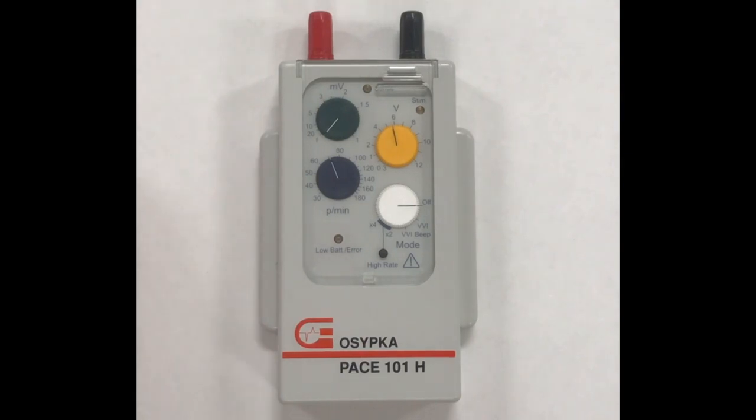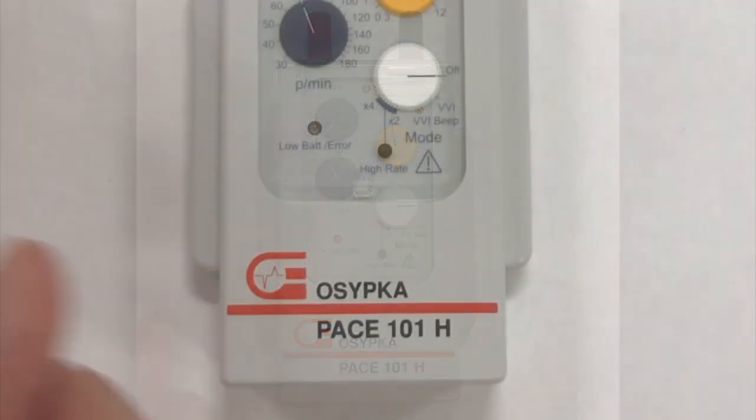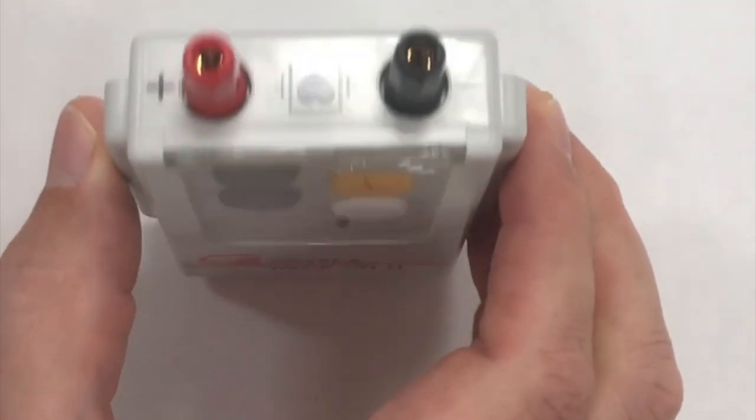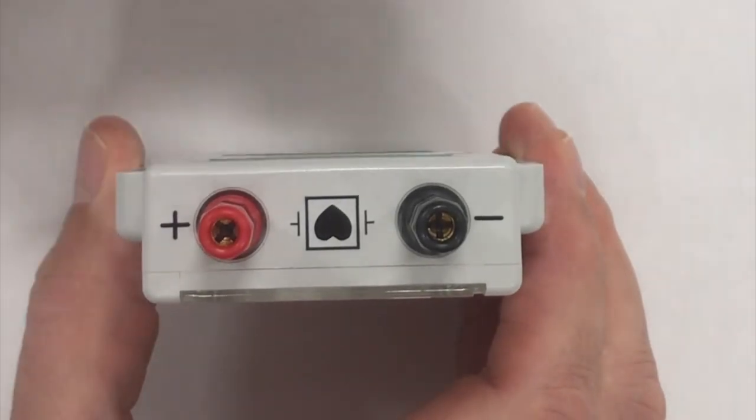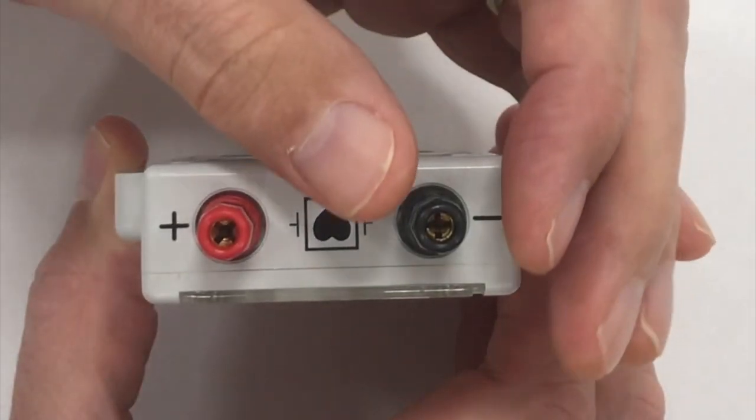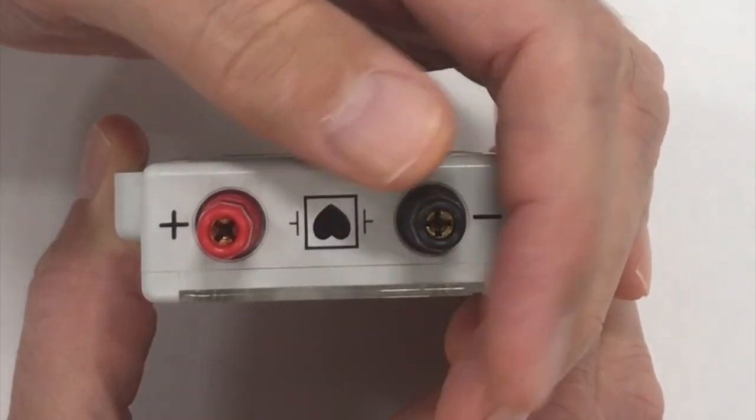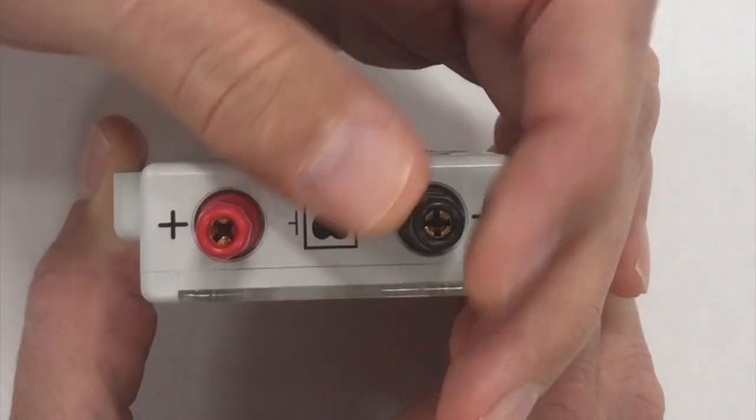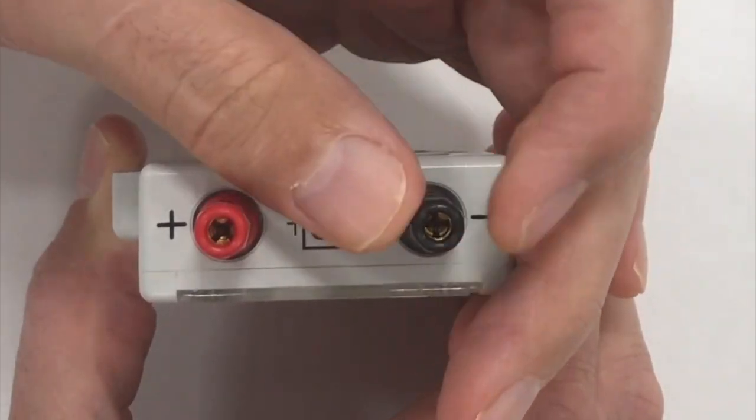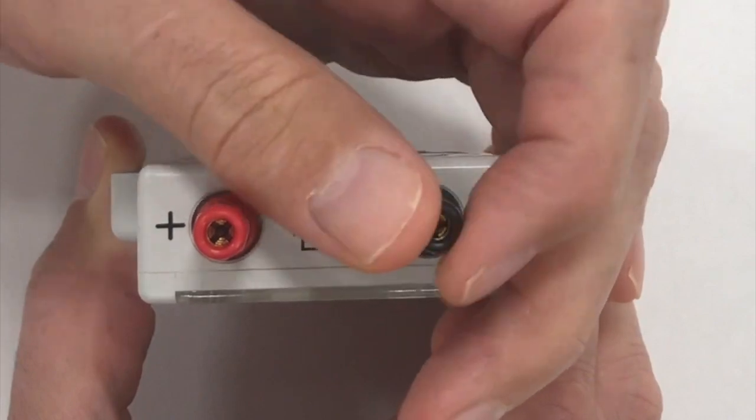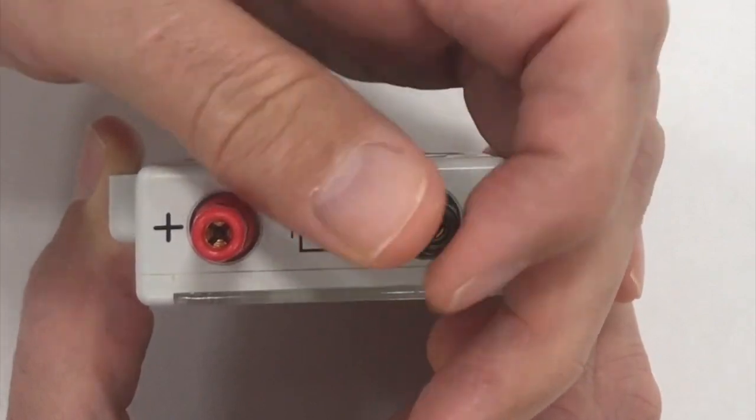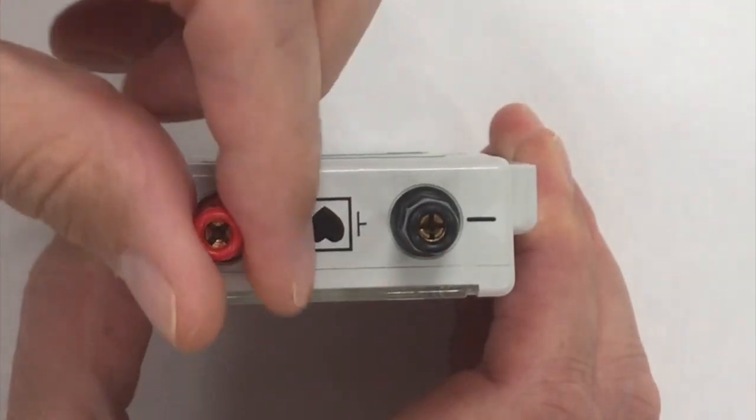To attach cables to the Pace 101, the top of the device has what's called rotating collets. That means when you rotate a barrel, it closes some jaws around a pin. And the pin it accepts is anything from 0.9 to 2mm.